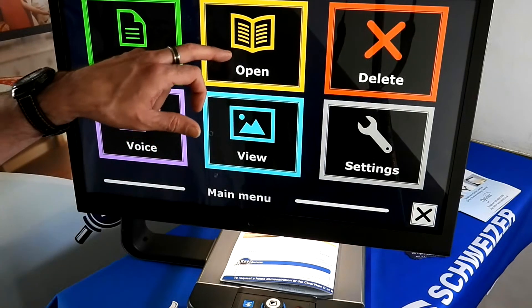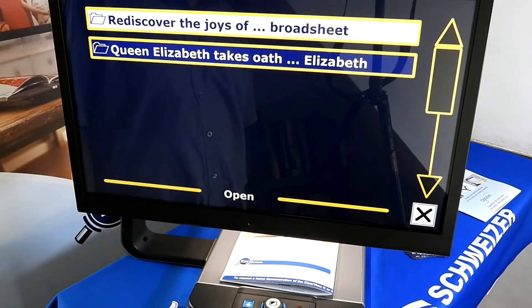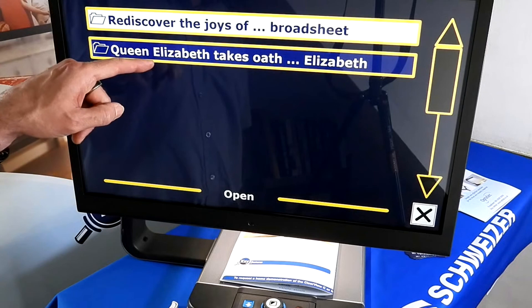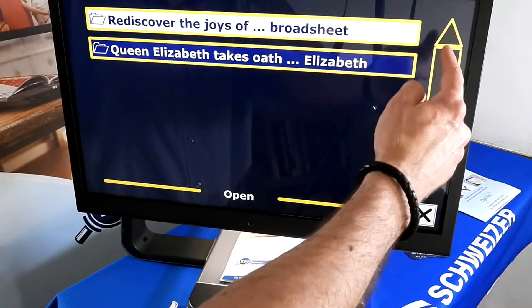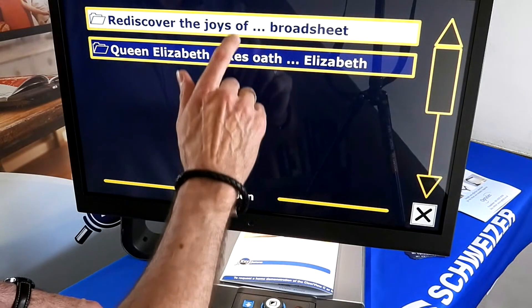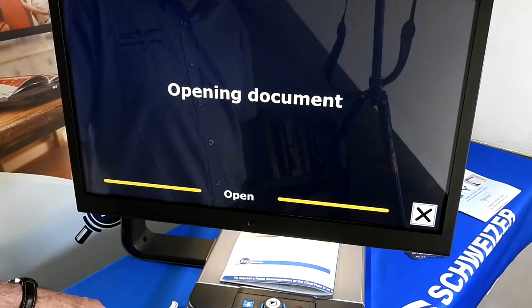If we now click on Open — Open menu, Open Document — we can see 'Page 10', which was the document we just saved, along with a previous document as well. Depending on how many documents you have, you would use the up and down arrows to scroll through and find the one you wanted, then tap on the document you want.